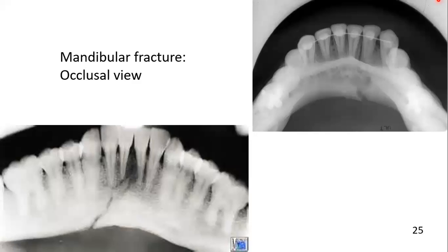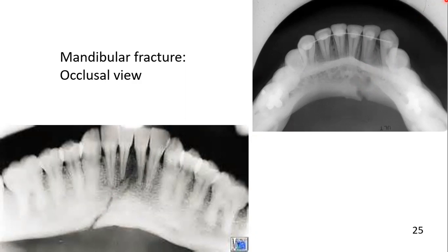This is the resultant image, and you can appreciate the fracture in the symphysis area. Both these radiographs are taken at 90 degrees occlusal for the mandible.